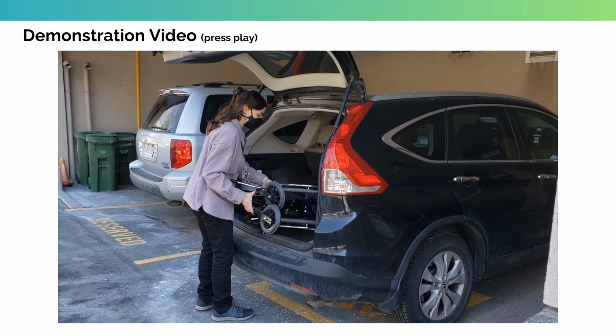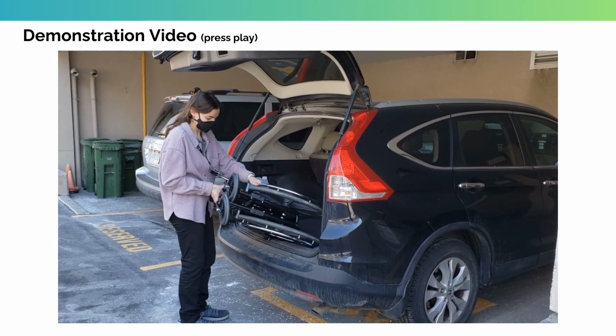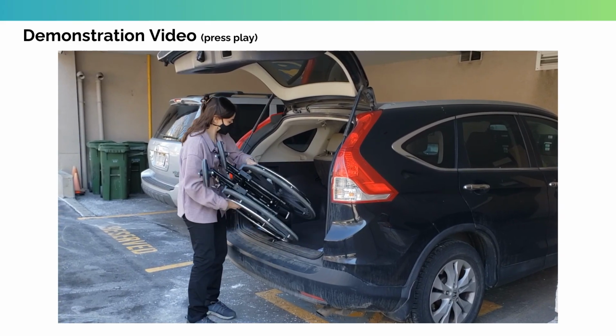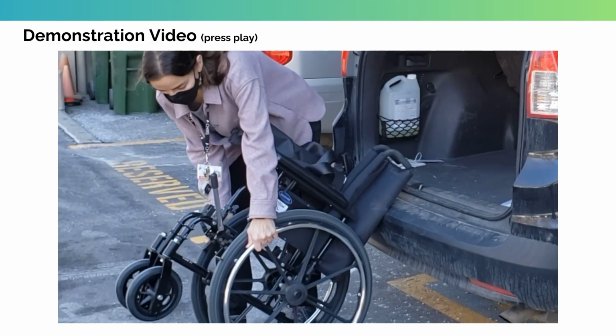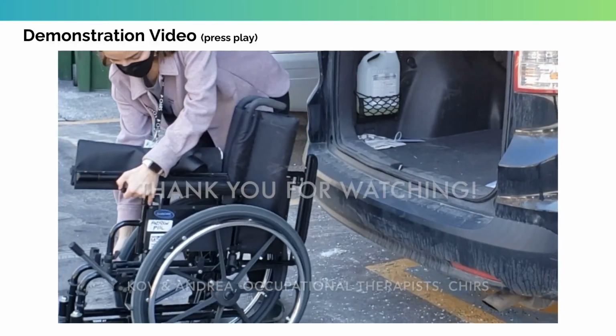To remove the wheelchair, simply reverse this process by first pulling it out closer to you, then grabbing both wheels, swinging the chair towards you, and leaning the back onto the trunk before lowering it down.